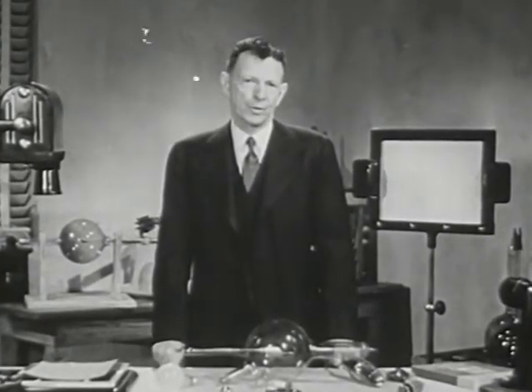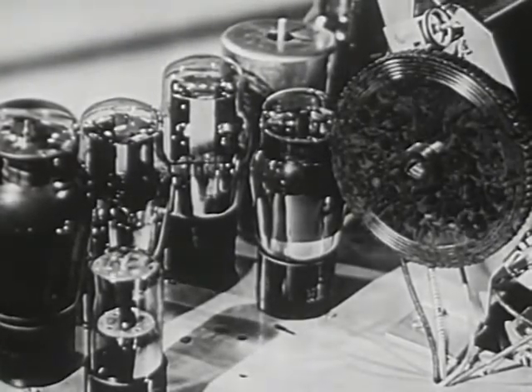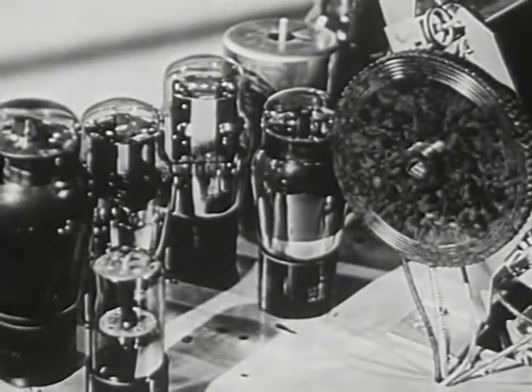For a long time, after X-rays were discovered and used, they remained a mystery even to the scientist. That is how they got their name, X for the unknown. Today, however, we know that X-rays are a form of radiation belonging to the same family as light, heat, and radio waves. We know also that X-rays are produced whenever a solid target is struck by a high-speed stream of electrons, those same little negatively charged particles of electricity which make our radio tubes work.